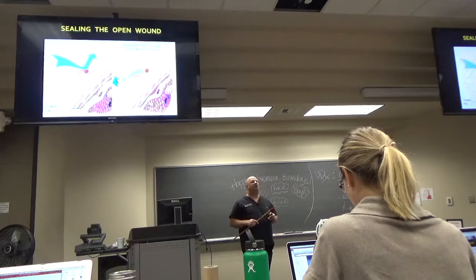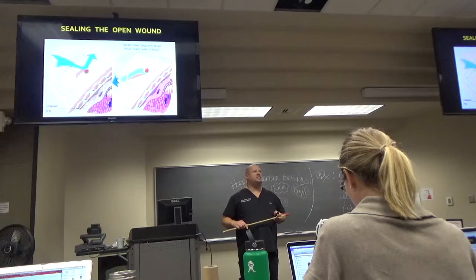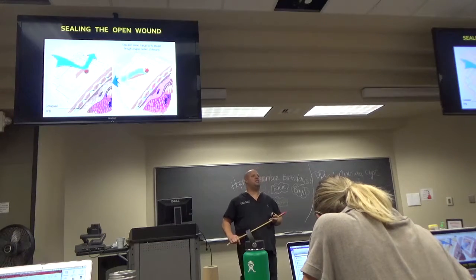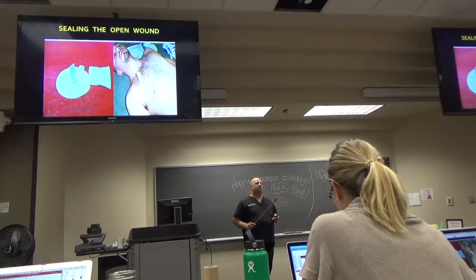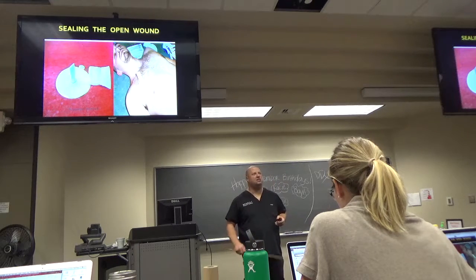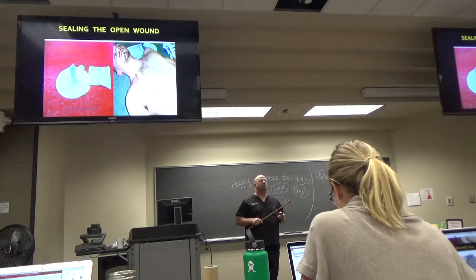This is kind of the concept we talked about, the older days of how we seal. You have the collapsed lung, and the expiration allows the trapped air to escape through the section of the dressing that's not taped. Get the concept? This is something that's kind of old, but not really used much anymore. This is called an Asherman chest seal, something you can put over it. Again, it's a little flapper, a little one-way valve, okay?